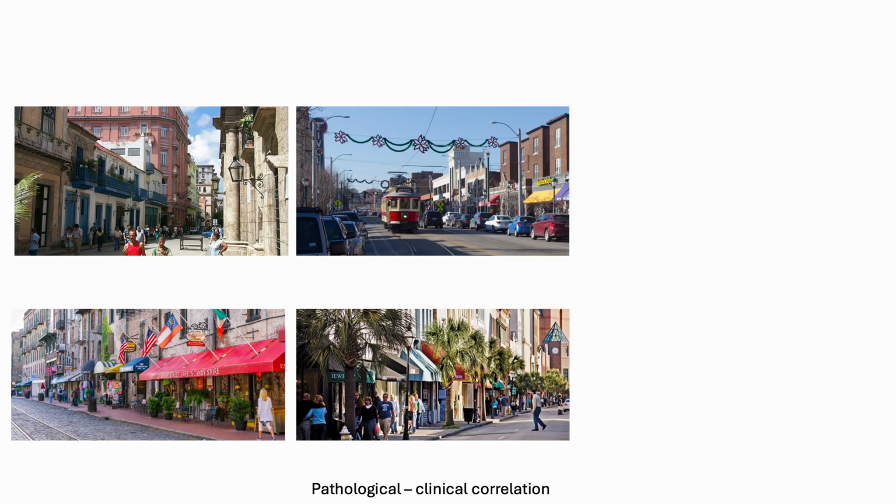But things are not always perfect. Here I'm giving you 4 pictures. They resemble New Orleans. There are streetcars. There is something that looks like Canal Street, but actually none of them were taken in New Orleans. I call them 4 mimickers. And let me tell you, they are from Cuba, St. Louis, Missouri, Savannah, Georgia, and lastly, Charleston, South Carolina. And I can give them a pattern. I can call it a NOLA pattern.